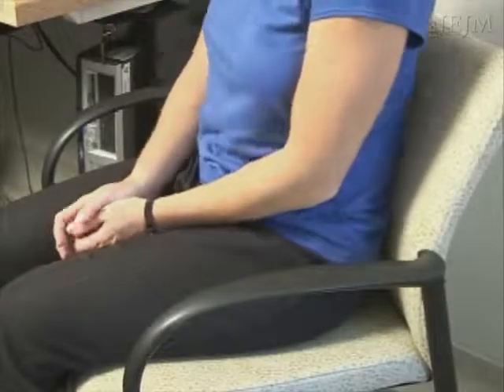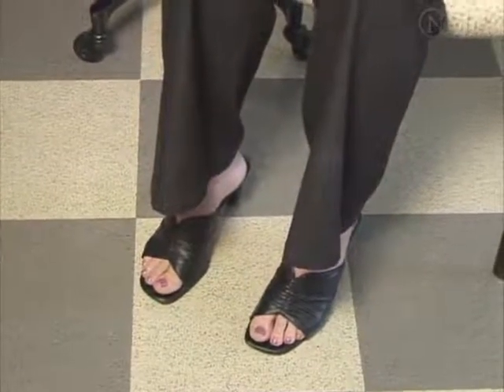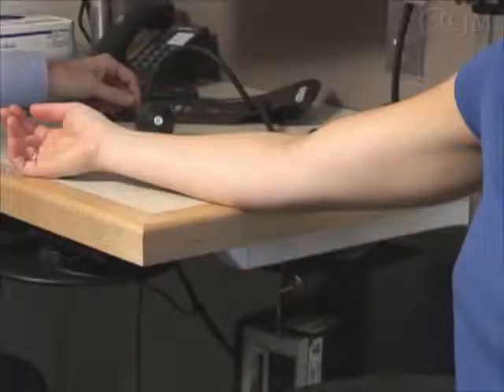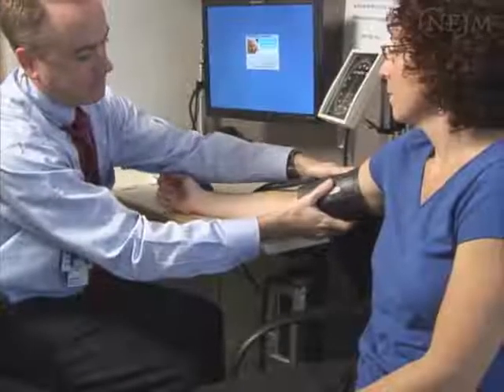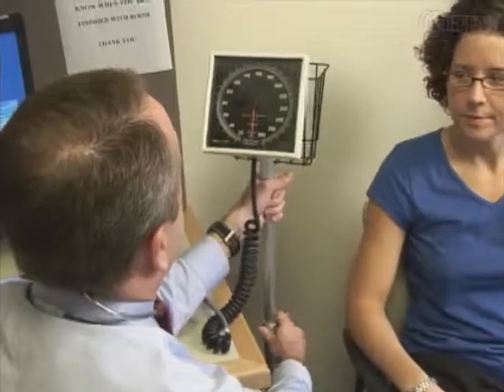Correct positioning of the patient is essential to accurately measure blood pressure. The patient's back and legs should be supported with legs uncrossed and feet resting on a firm surface. The patient's arm should be bare to the shoulder. The arm should be supported at heart level, and the manometer should be at the eye level of the healthcare practitioner.